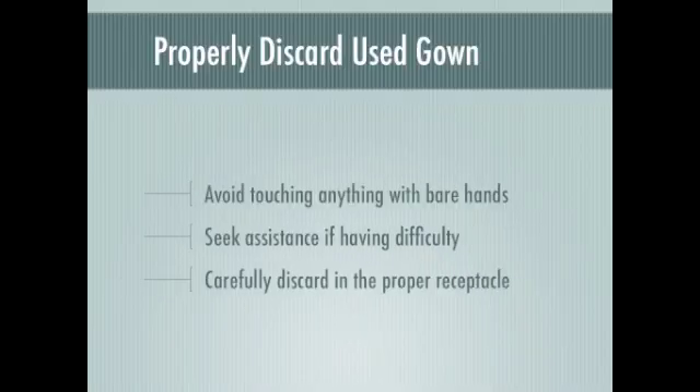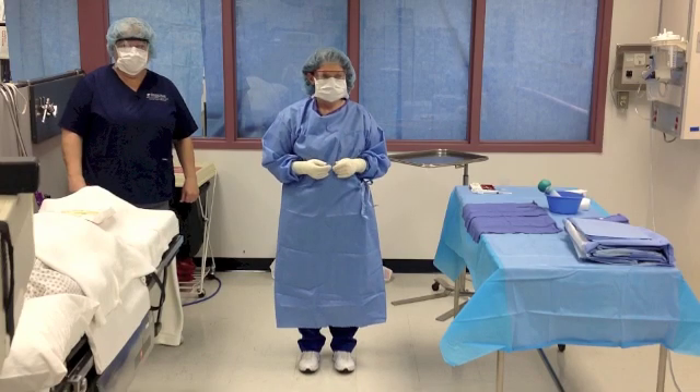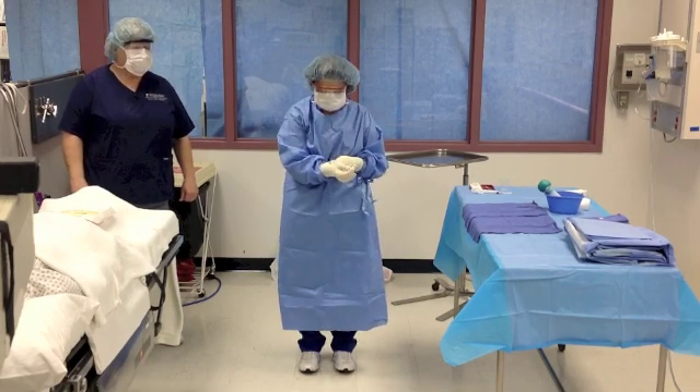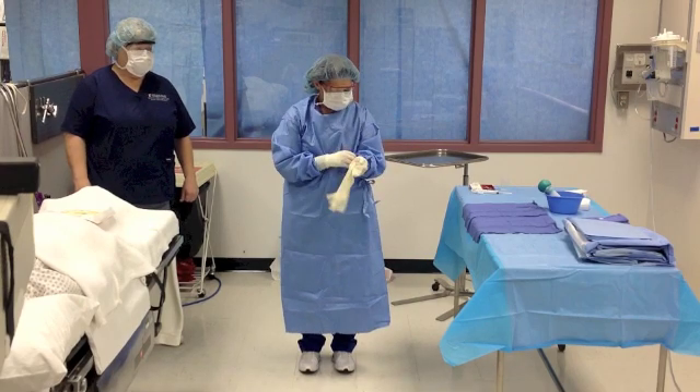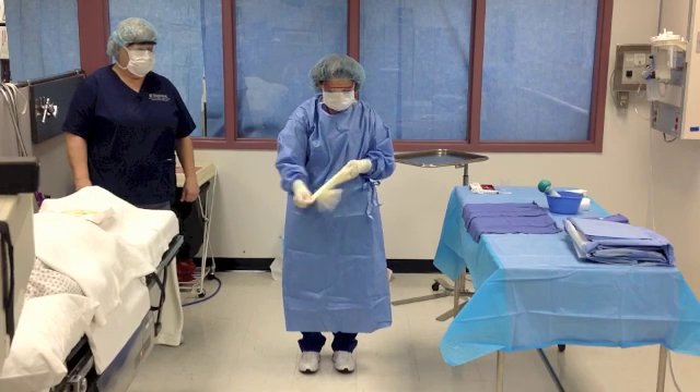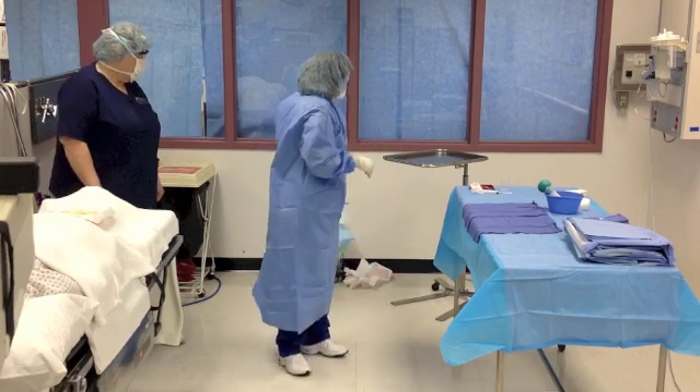Now that the case is over, you can remove your own gown and gloves. Some surgical technologists remove the outer pair of gloves to make this process easier. Remove the first pair of gloves by grasping the palm of the glove with your opposite hand and pull the glove off. This will turn the glove inside out as it is removed. While keeping the removed glove in your gloved hand, slide your bare fingers inside the cuff of the gloved hand. Roll the gloves off your hands and dispose of both gloves into a biohazard waste receptacle without touching the outside of the gloves.